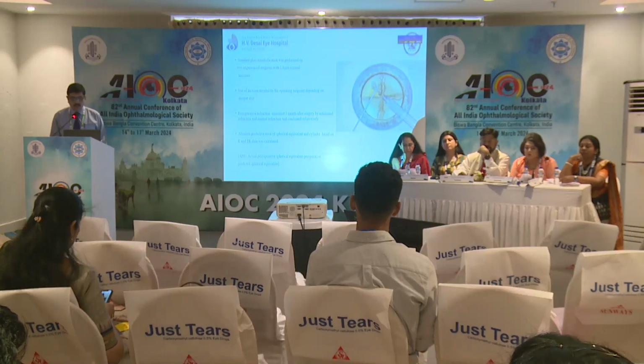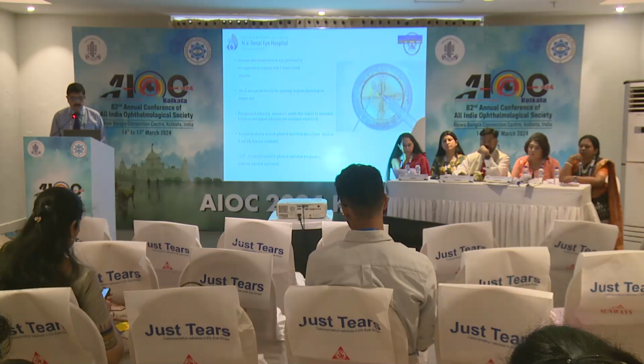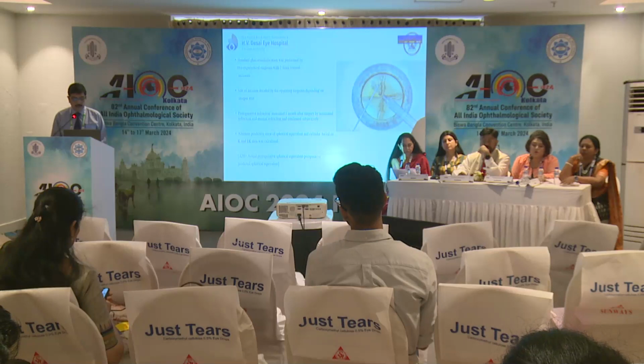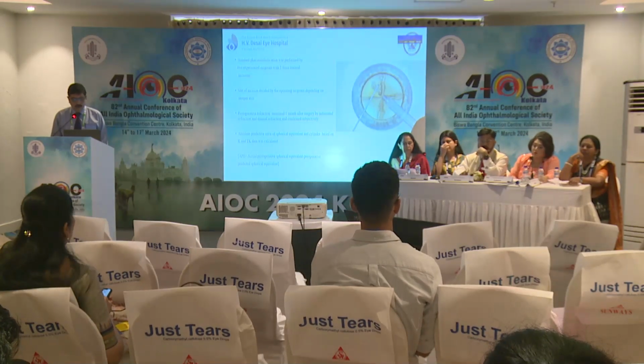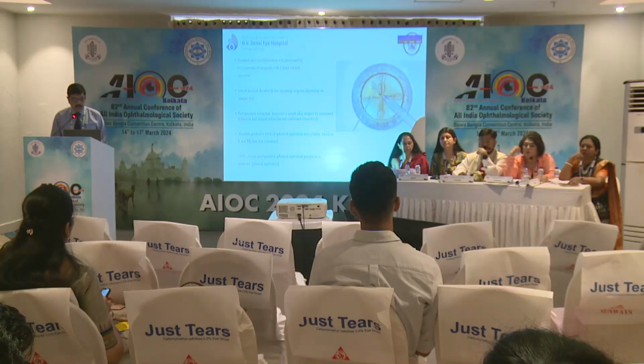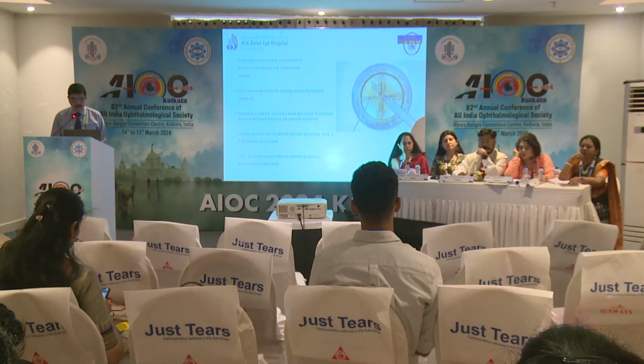Post-operative refraction at 1 month after surgery was measured by automated refraction, manual refraction, and confirmed subjectively. Absolute predictive error for K and TK was calculated. Absolute predictive error was the actual post-operative spherical equivalent minus the pre-operative predicted spherical equivalent.